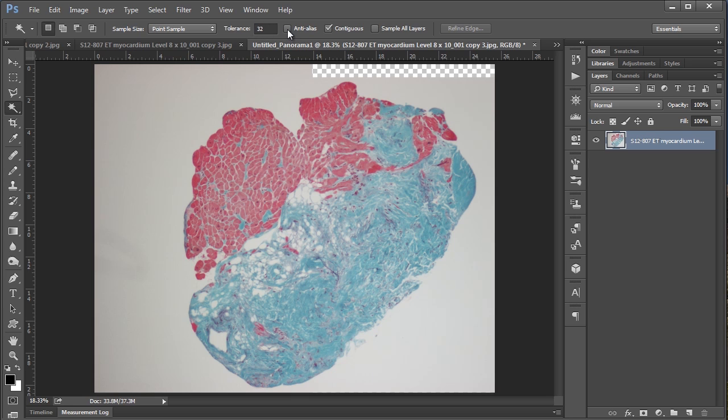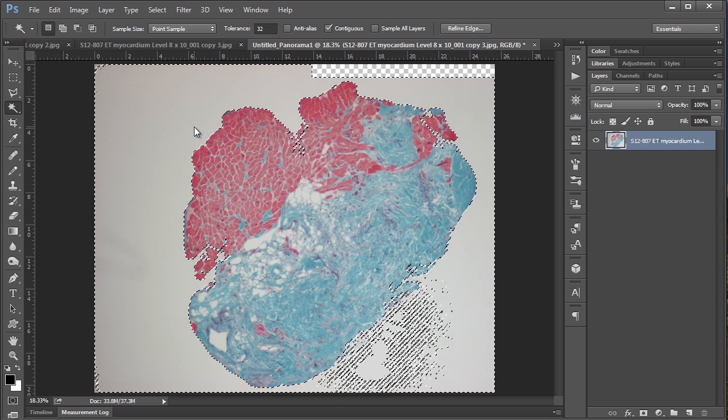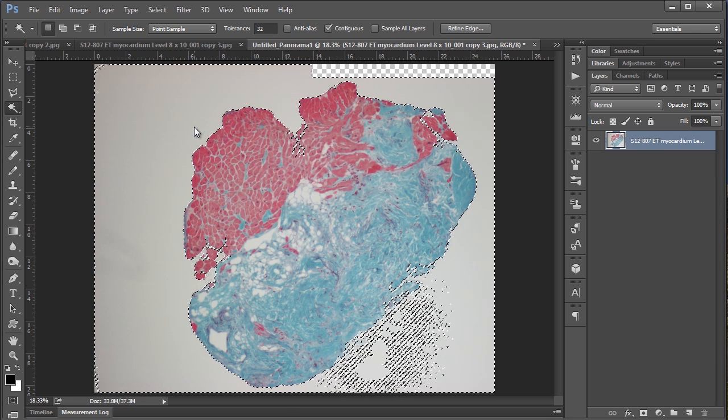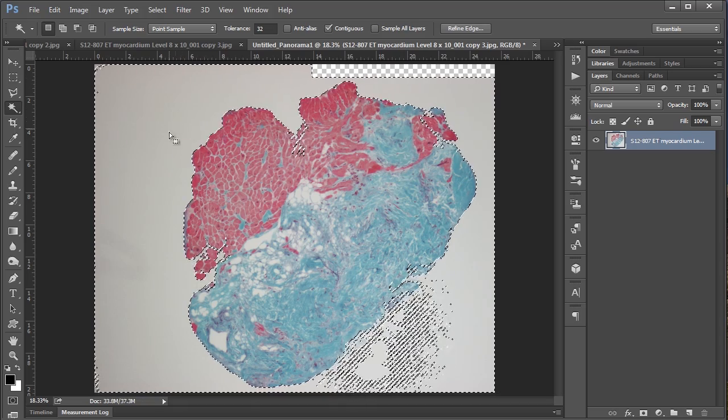Anti-aliasing we want unchecked because we just want a hard black and white selection. Contiguous we do want to check because we just want to select this outer area and none of the white area in the middle of the biopsy here. And sample all layers is irrelevant for our purposes because we only have one layer. So if we just click anywhere outside the heart, right off the bat we have a pretty good selection.